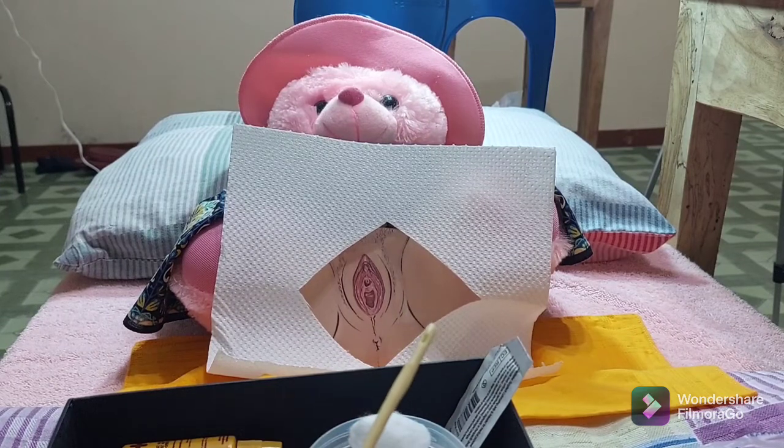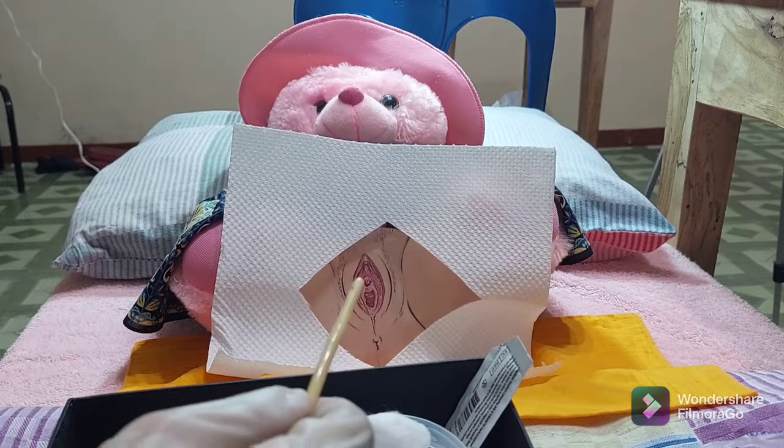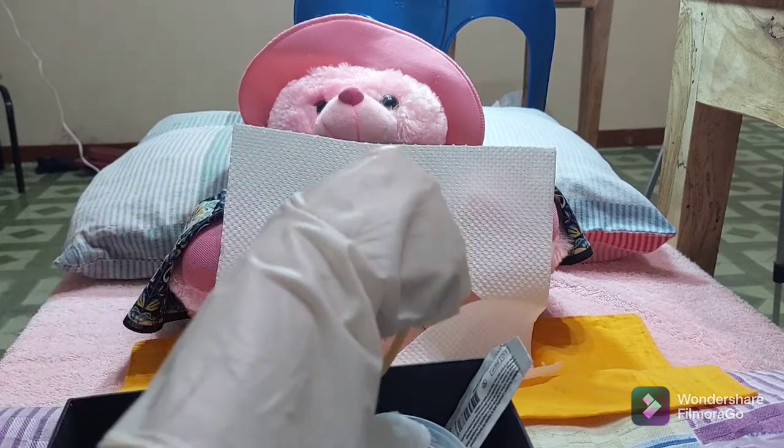Insert the catheter as follows. In female patients, ask the patient to bear down gently to help expose the urethral meatus. Advance the catheter 5 to 7.5 centimeters until urine flows from the catheter. Then advance an additional 5 centimeters.